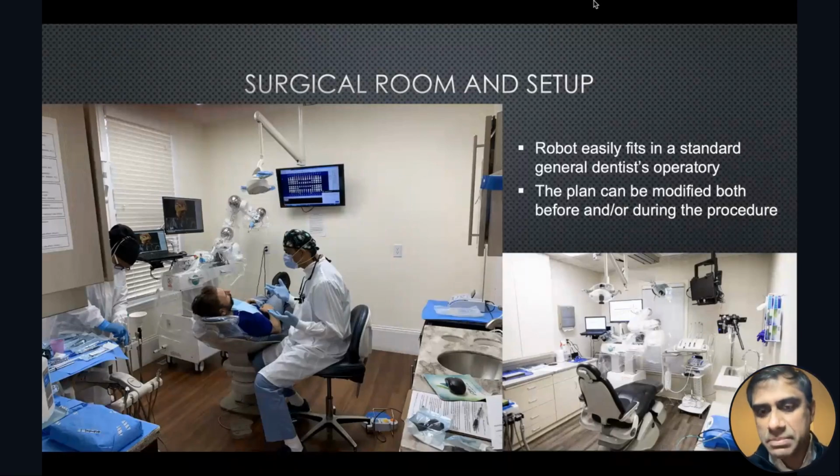So that's where all the controls happen, and that's where the person is called the robotic coordinator. I talked about being a rock band, right? This is where the importance of team integration happens. This is where everyone is involved for the best outcome of your patient.